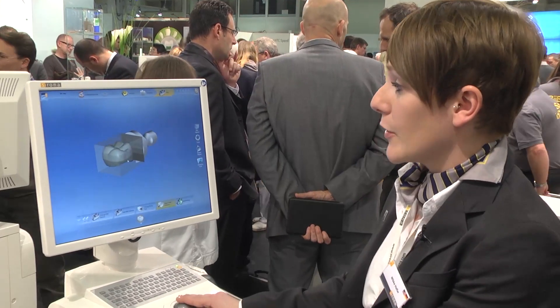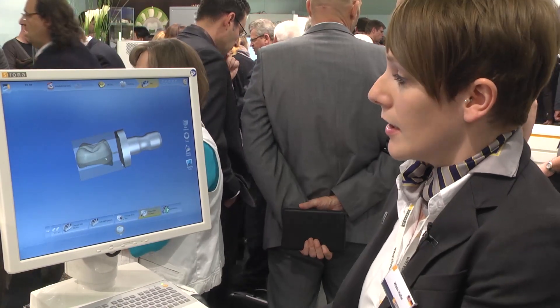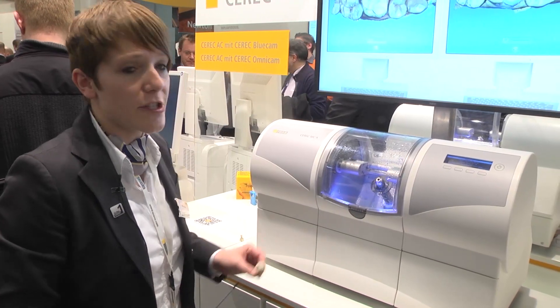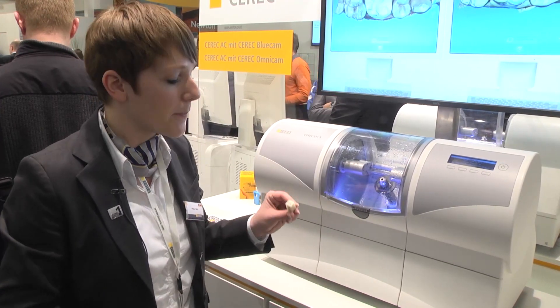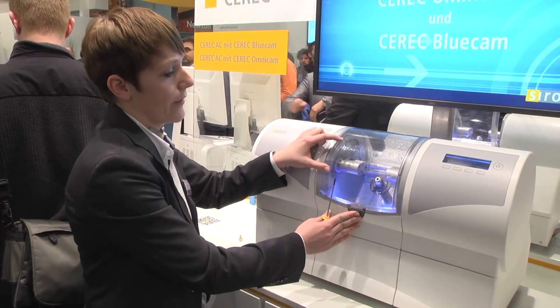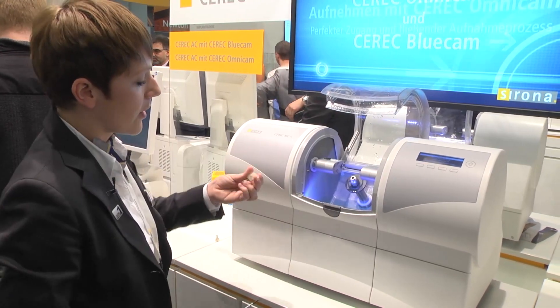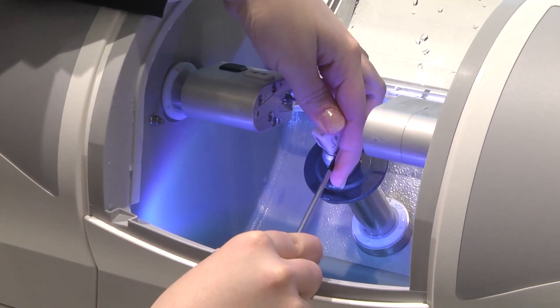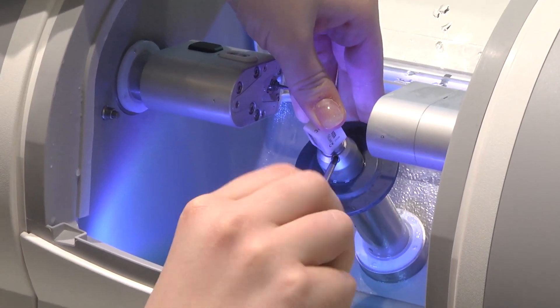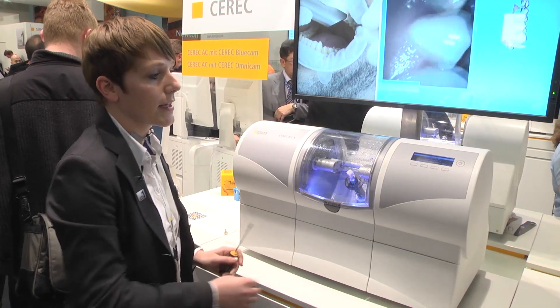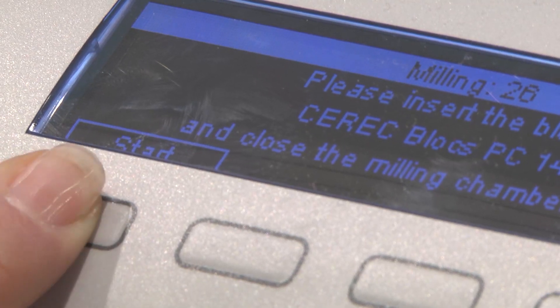We calculate the mill preview and can see the polychrome block with the crown positioned inside it. To start the milling process, we first insert the CEREC block — in this case the CEREC block PC, the polychrome one. I open the door, insert the block, secure it with the screwdriver, close the door, and start the milling process.